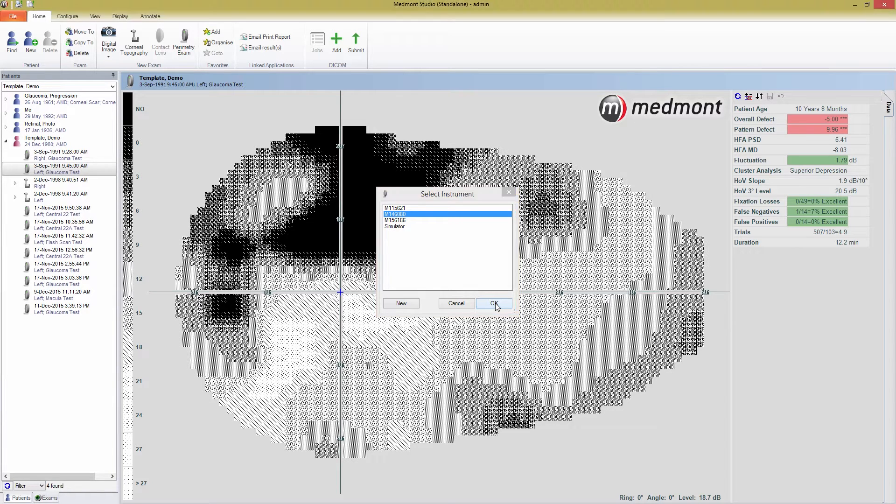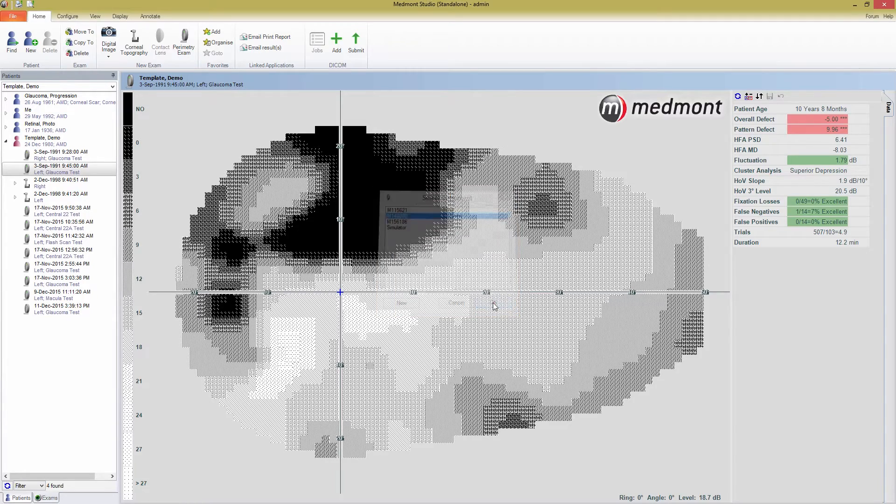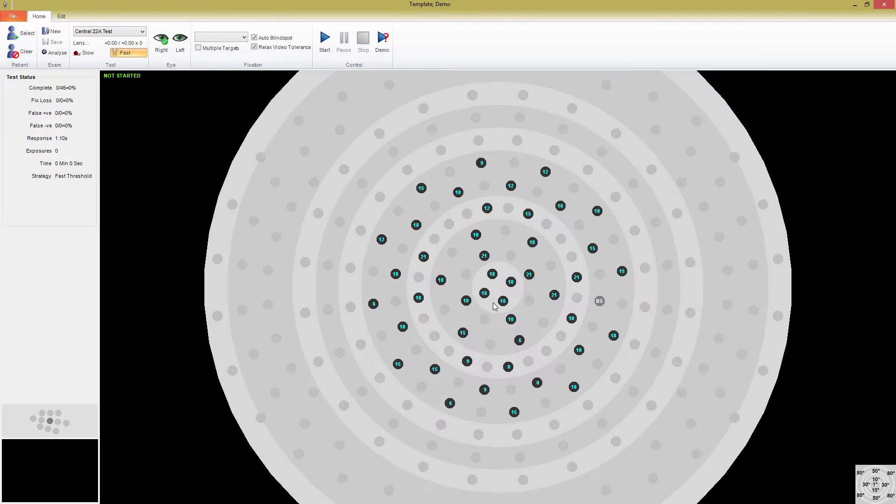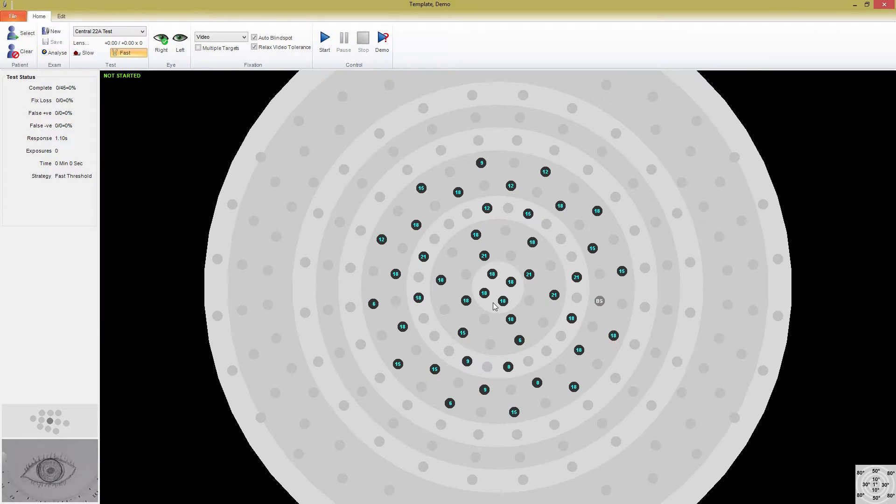Now that we've opened the perimeter test window, we're ready to start an exam. This window is separate from Medmont Studio, so if you close it, Medmont Studio will still be running in the background.